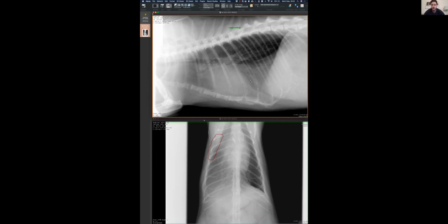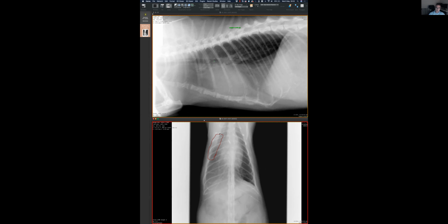So likely extrapleural disease because of the fact that it's similar soft tissue opacity to the wall and it's a convex pattern kind of contour coming off the wall. Is that what you're saying? Yeah, so I really buy that, and that is an important finding. It's acting like an extrapleural sign, like a pleural disease, displacing the lung, separation of the lung from the wall. That I buy. So that is helping me to think that it is in the pleural space.